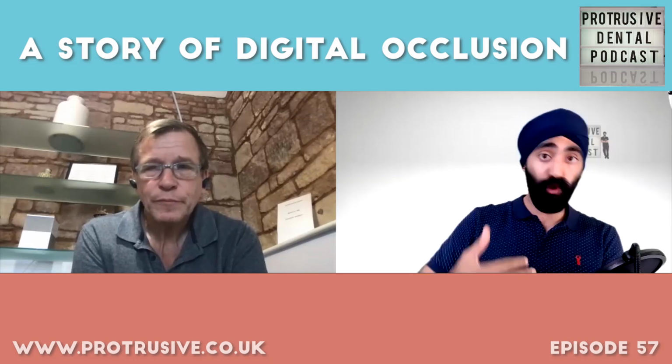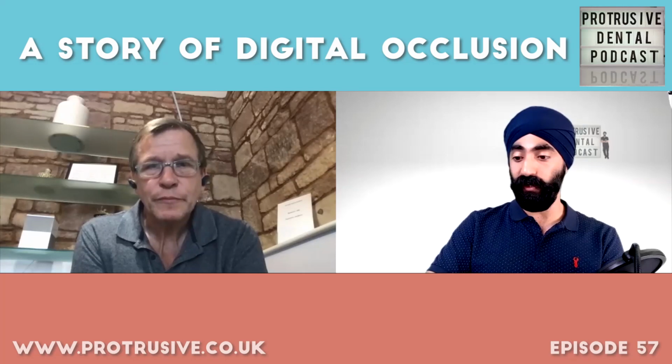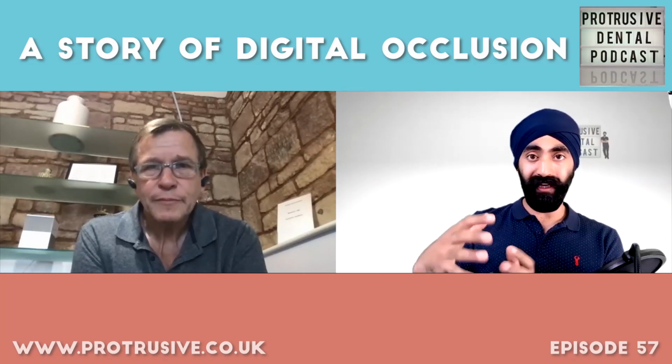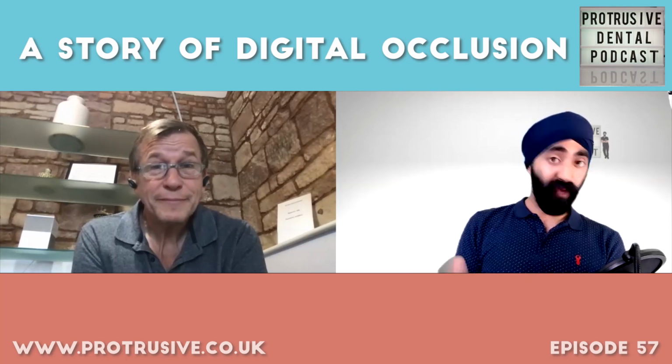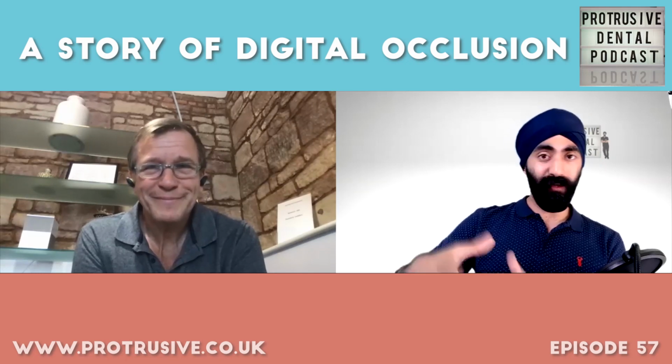And this is after usually I've deprogrammed them. We're using a deprogramming appliance, and that's a whole other section we can talk about. I found that when they bite together, I've got these beautiful contacts, and the excursions are just where I want them. So it just needs a bit of polishing. The first time I did it, it blew my mind. I thought I fluked it. Then a couple of times I did it, it became very reproducible.